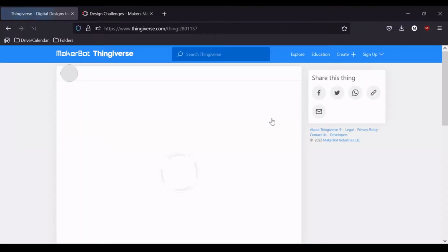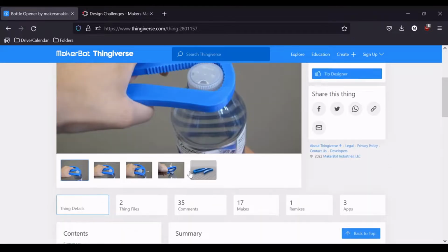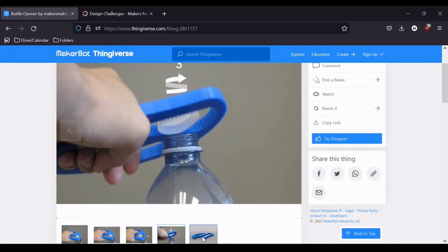In this particular case, let's look at the Makers Making Change design because they upload to Thingiverse. I know that there is testing and a feedback process for their prints, so I know that I can trust it. With that said, let's check out some of the available information.